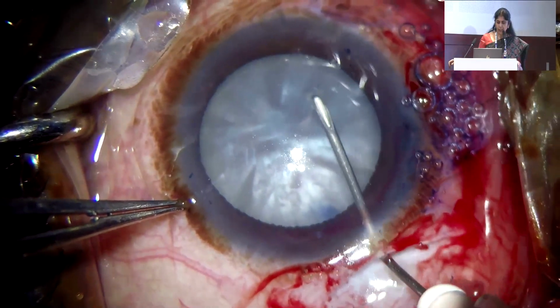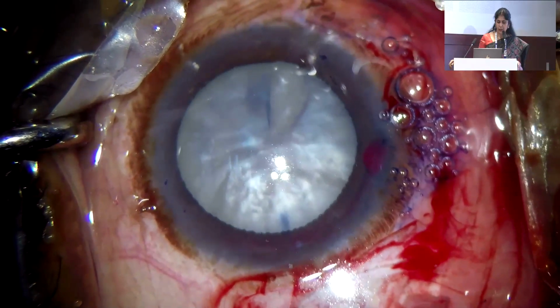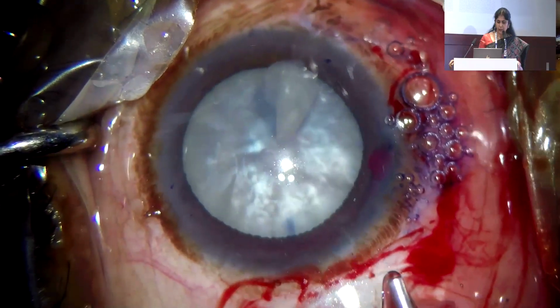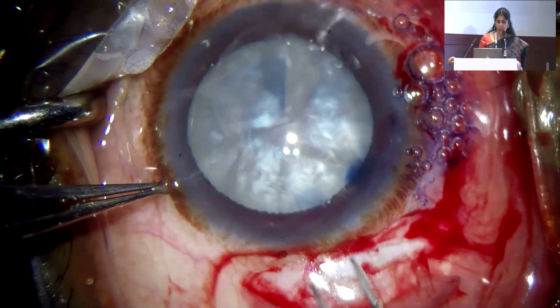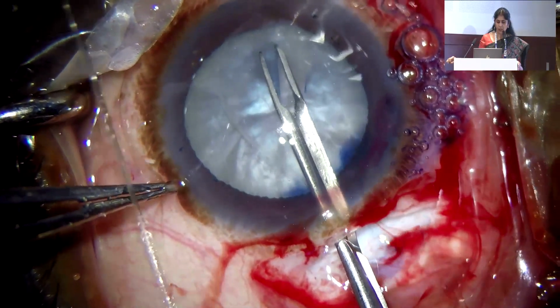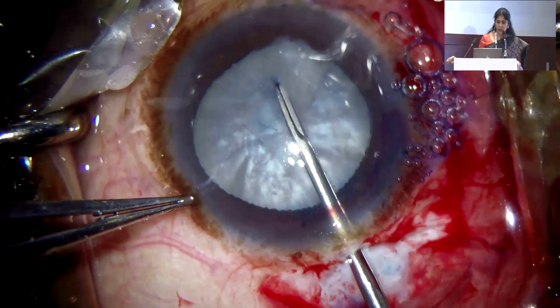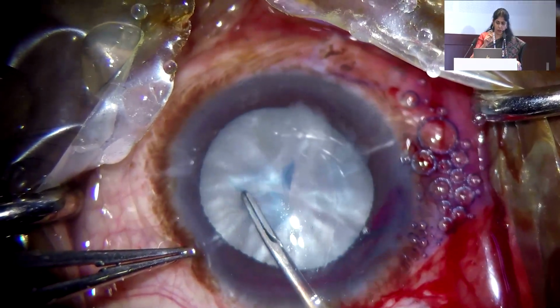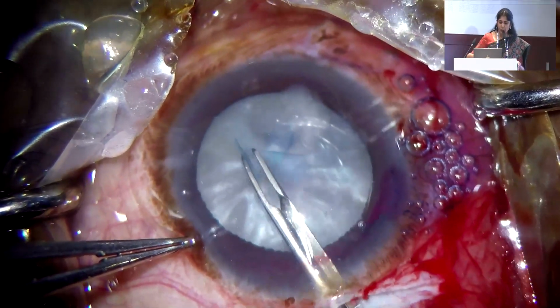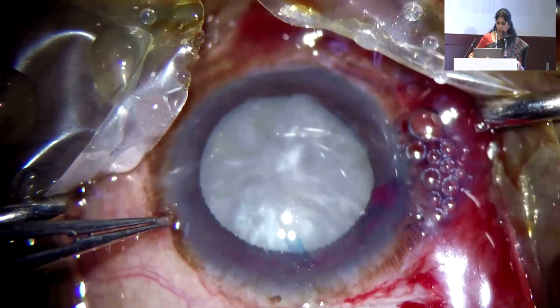Now, this is again an intumescent cataract, an SICS incision. The primary nick is made. Again, it's a large flap. It's tending to go out. At this point, one has to resort to using a forceps, go towards the edge, hold the edge of the flap, and you can see the movement. It's pulling backward, not forward. Normally with the rexus you go forward, but just look at the tip of the forceps. You don't go forward, but go backward.